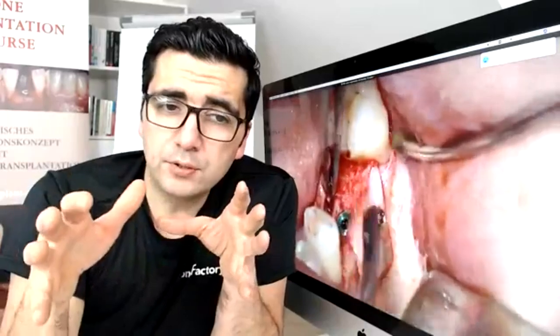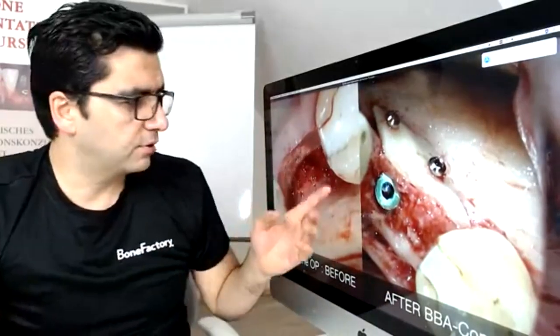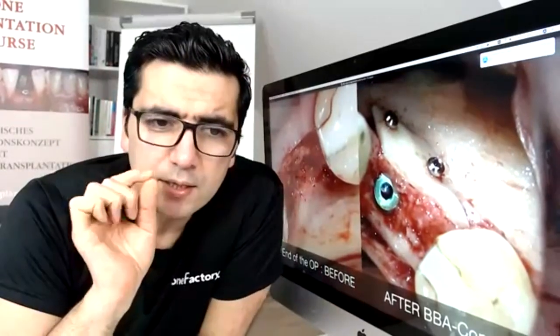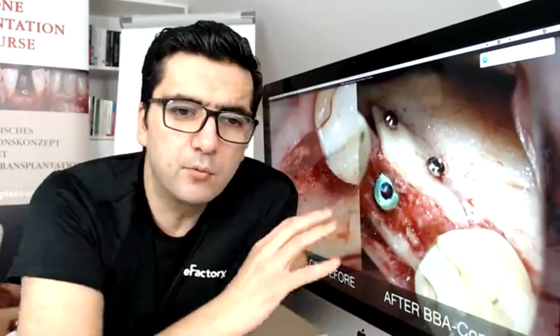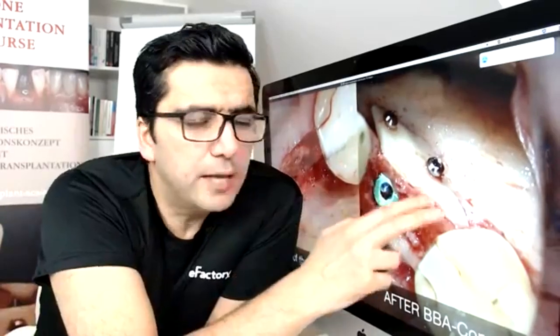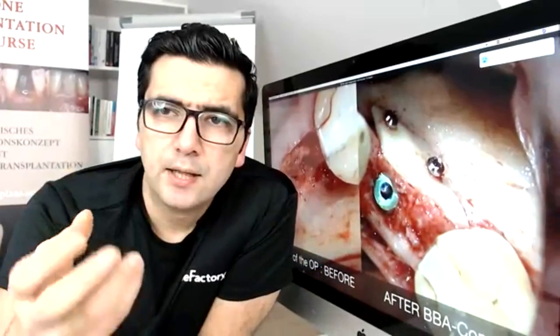Studies show which size is best for predictable augmentation. Chips under one millimeter have higher resorption. When you use the bone scraper correctly, you will get the optimum size. You can put these chips into the gaps to fill the space between the box and the defect. It is important to apply high pressure on the chips so there are no free spaces. You can see before and after the augmentation — the anatomical view resembles natural native bone, with a small cortical layer over a large spongy bone area.